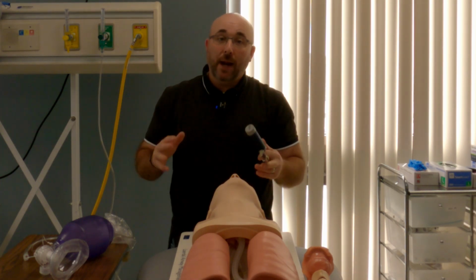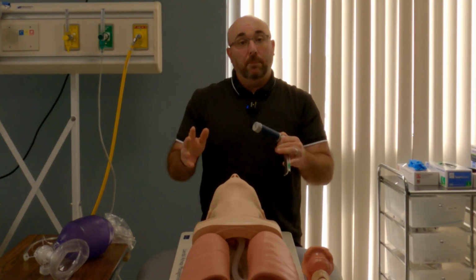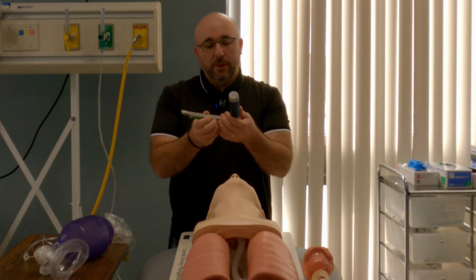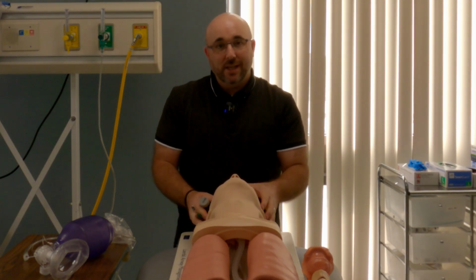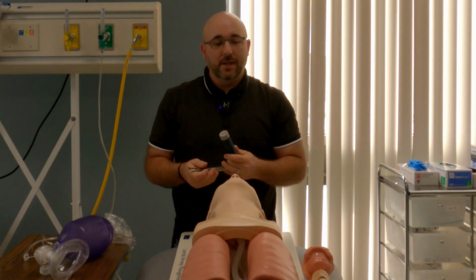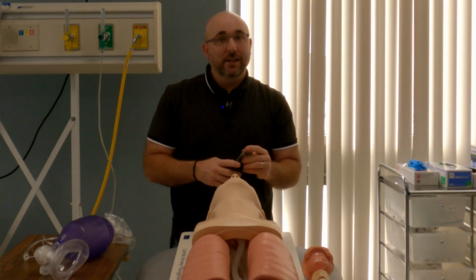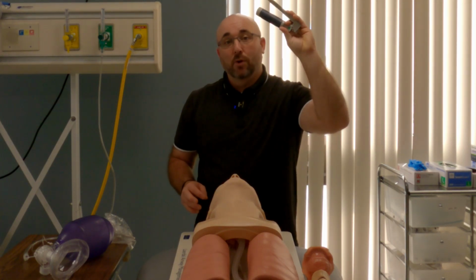So if you're preparing for intubation, you don't even have to be doing the intubation, but preparing, setting up, one of the things you're definitely going to check is make sure the laryngoscope light works. We always put the blade in, we turn it on, make sure it works. You don't want to get down into this, looking in the oral pharynx and turn this blade on and the light doesn't work, because what you've done at that point is you've probably hyperventilated the patient a little bit, you got them fully sedated, and now you're scrambling to find that piece. So making sure the laryngoscope blade works is number one.